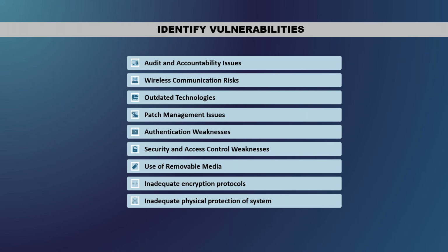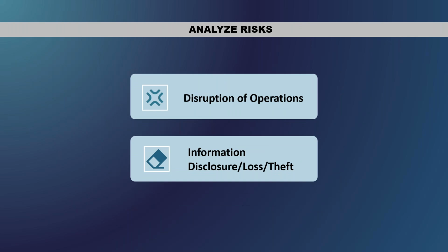And then many network connected devices can also operate in public. So that could also present physical security risks. If someone follows you into a telecom closet, or if it's a TV or workstation that's just out in the public emergency department area, they can tamper with it.